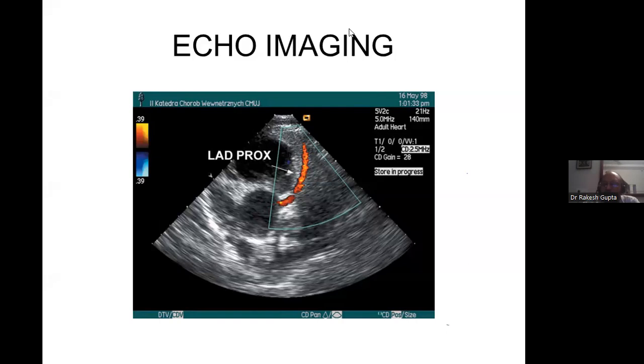Dr. Achal: Yes, ma'am, I wanted to ask, when we are measuring right atrium volume, area, or left atrial area, what is the best time to measure as per the cardiac cycle? Is it mid diastole? In the pictures I felt like the mitral valve is closed, but most of the time we do it when it is at maximum open. No. You are supposed to do it in the frame just before the mitral valve opens. Just before it opens. Okay. Yes, that means fully distended. It's the end of systole of LV. Yeah, fully distended. Okay, thank you, ma'am.